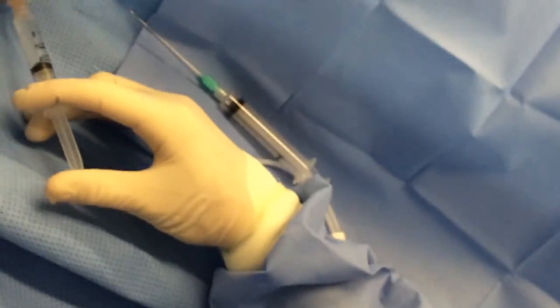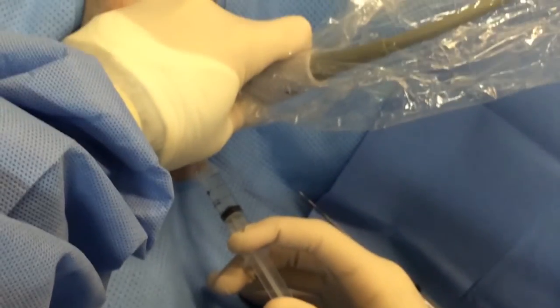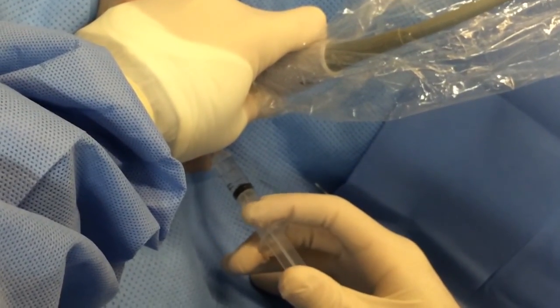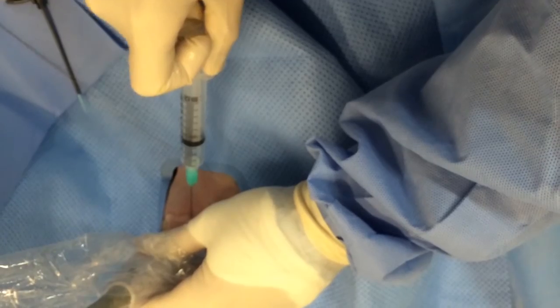He's injecting local anesthetic from the kit. He's not going to blow his whole wad here. He's going to use about half the syringe for the skin anesthesia. We'll talk in a little bit about why you want to save about half of that syringe, because you're going to need to anesthetize a different spot later on. There's that big fat vessel.